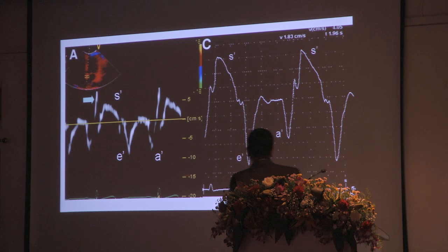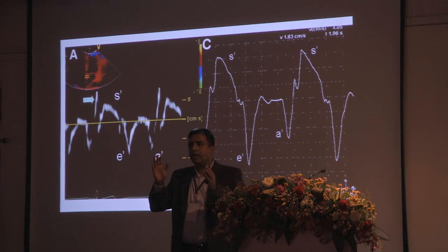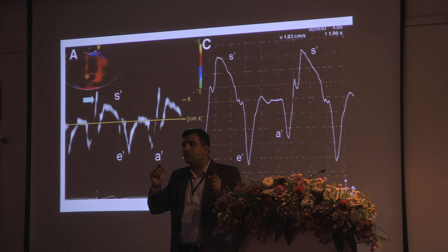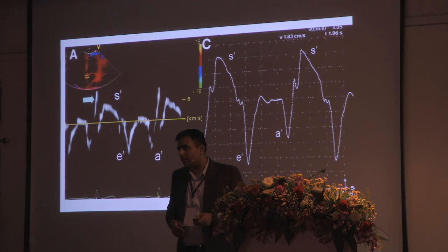So my aim in the next 10 minutes is to explain this curve to you, so that you will be able to understand what these curves mean. My request to all of you is to stop me and ask any clarifications, because that is very, very important.